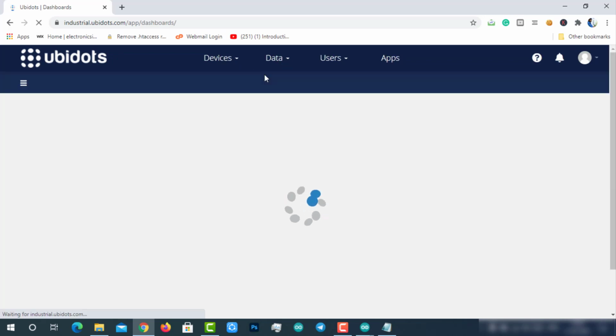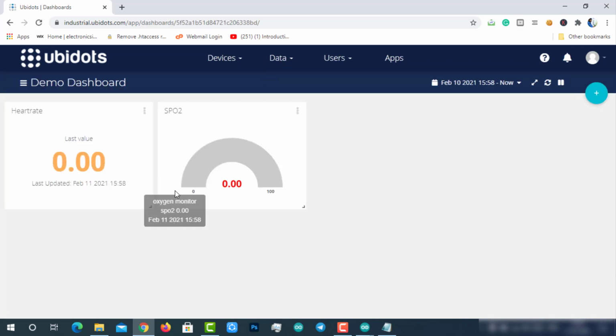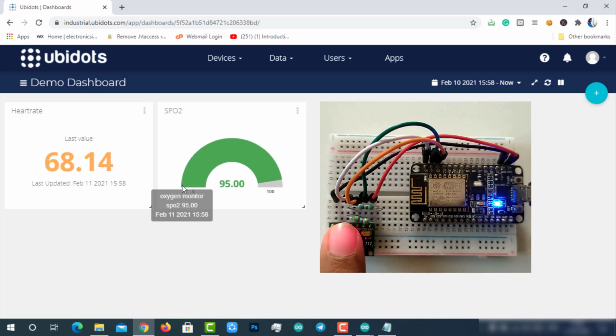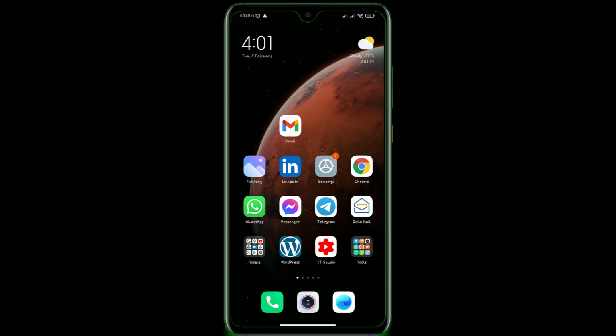Now it's time to test the back to normal alert feature. To make this SpO2 greater than 95 percent, I am going to place my finger on top of the sensor, so it will send the exact readings of my body, which will satisfy the event condition to trigger the back to normal alert. Yes, after one minute we have received a voice call from Ubidots again. Let's lift it and listen to the back to normal message.